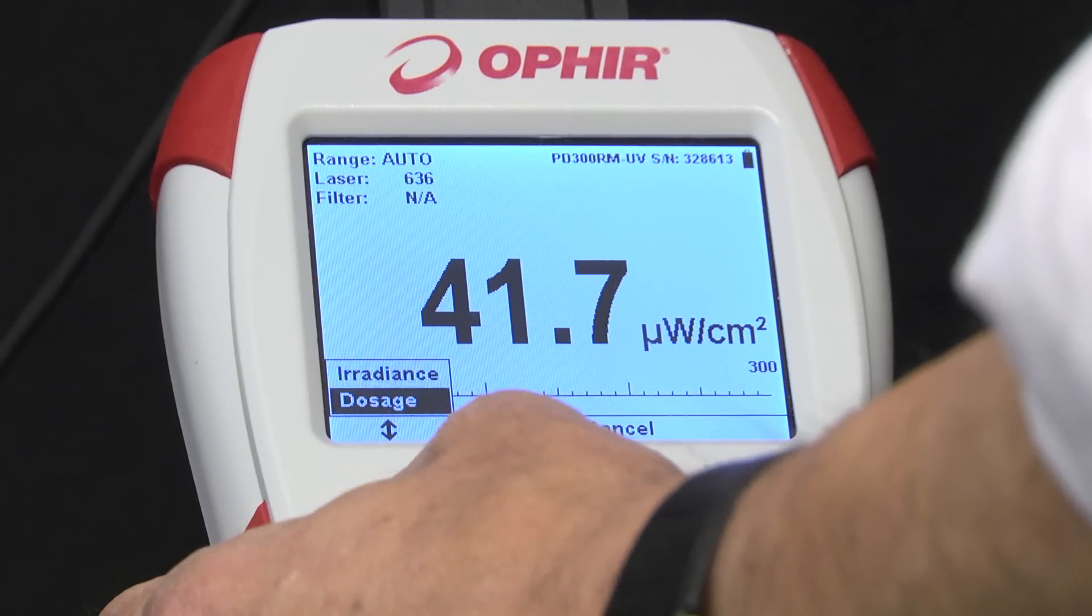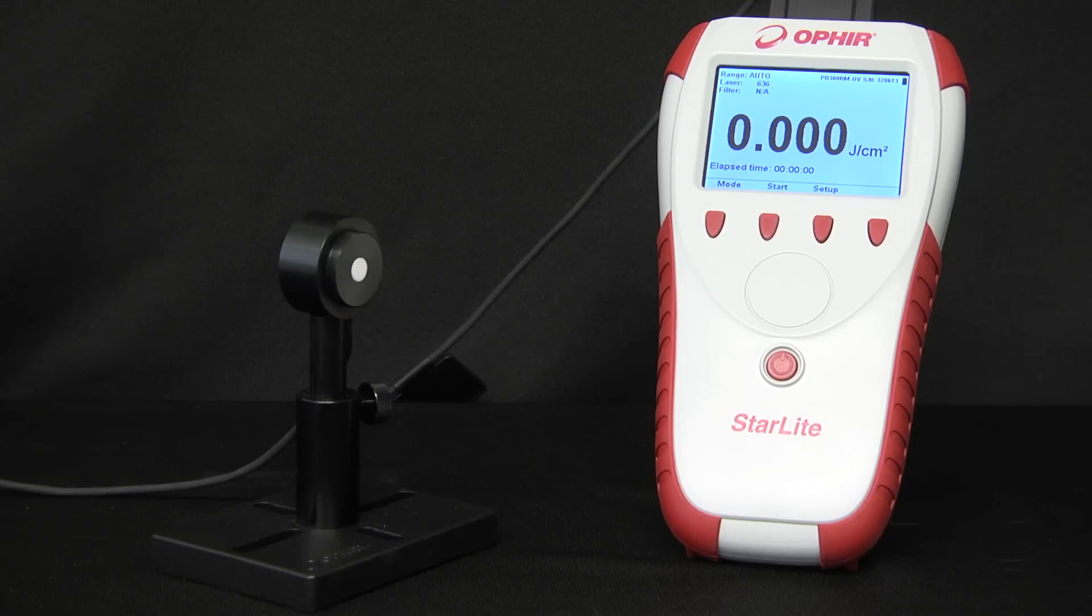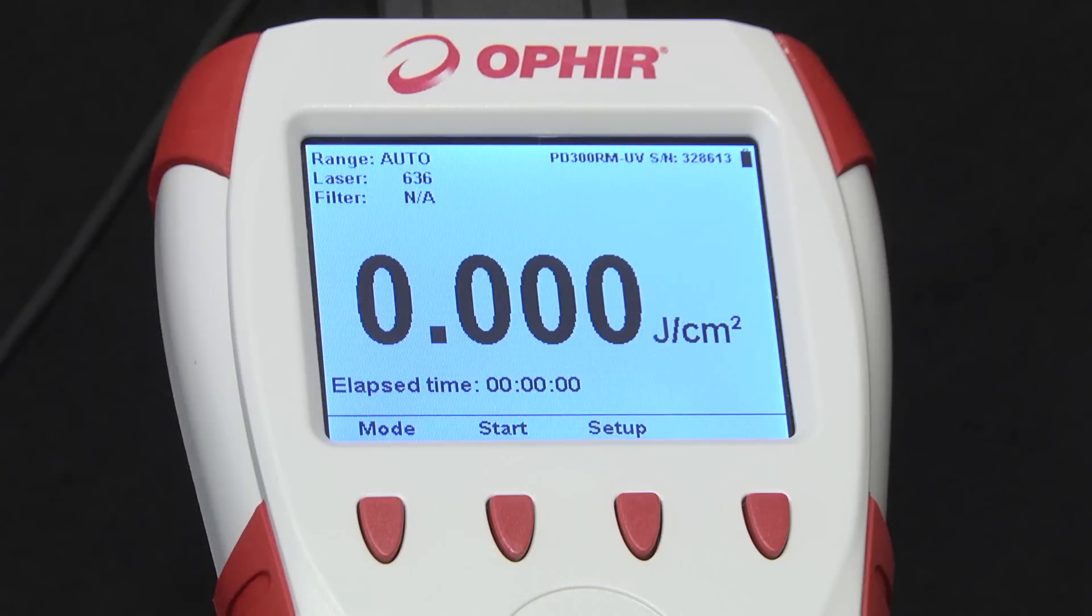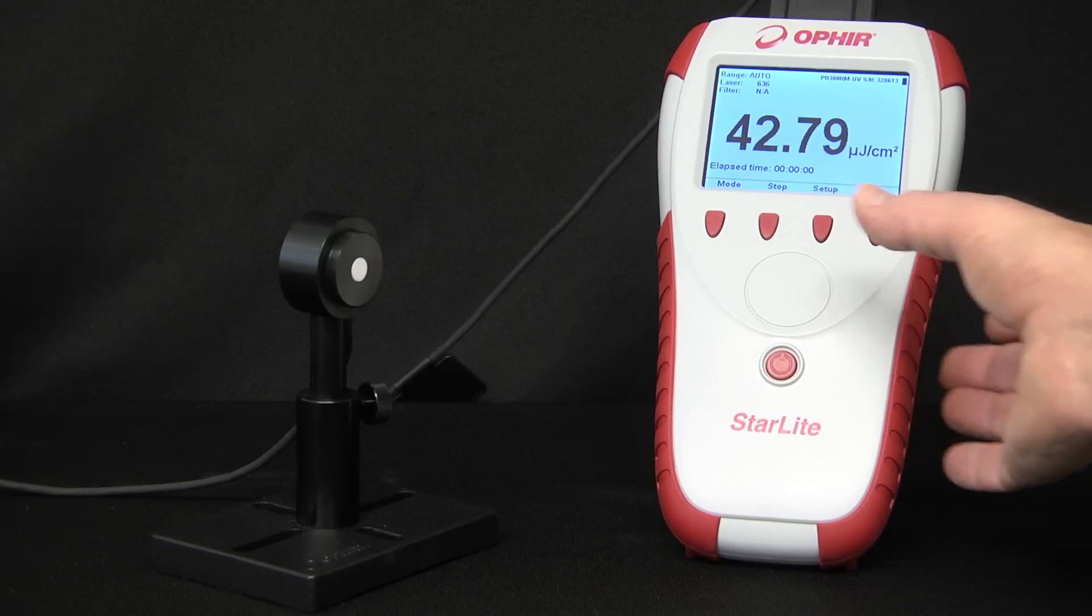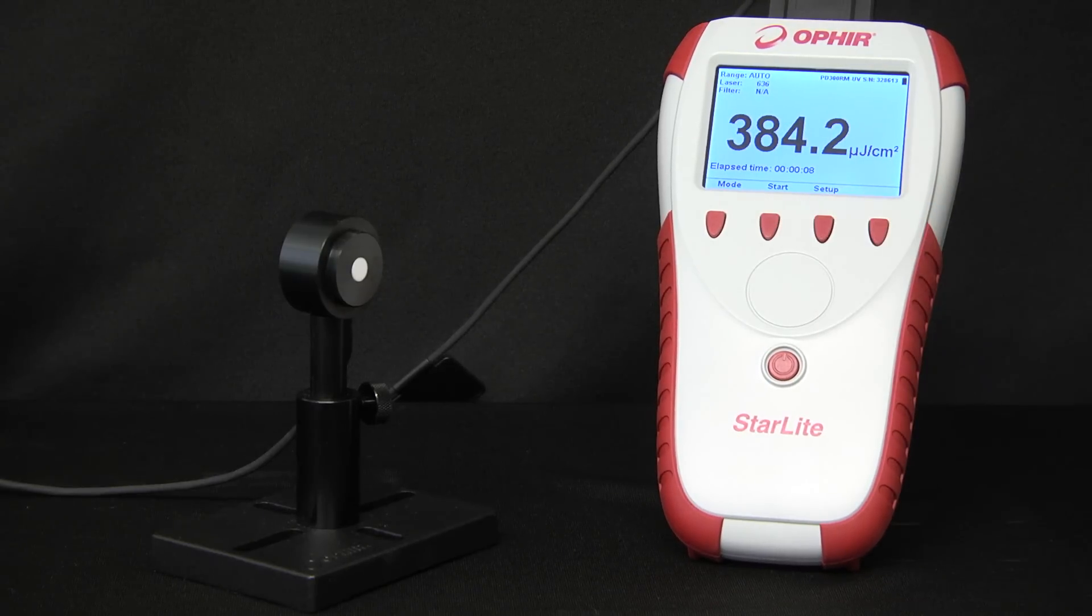In dosage mode, the PD300RM measures total accumulated dosage of energy per unit area in units of joules per square centimeter over a given time period. You press start to begin. An accumulative dosage is shown as the measurement progresses. You then press stop to end.